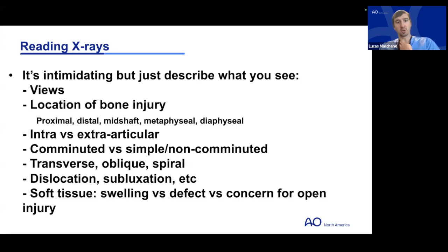So, reading x-rays. Dr. Stephenson, would you mind going over this slide and just giving us an idea of what the basic terms are that we use reading x-rays and give us an idea of really what your process is? Because in my mind, reading radiographs is truly a process. Give us an idea of what your process is when you're looking at a plain film radiograph.